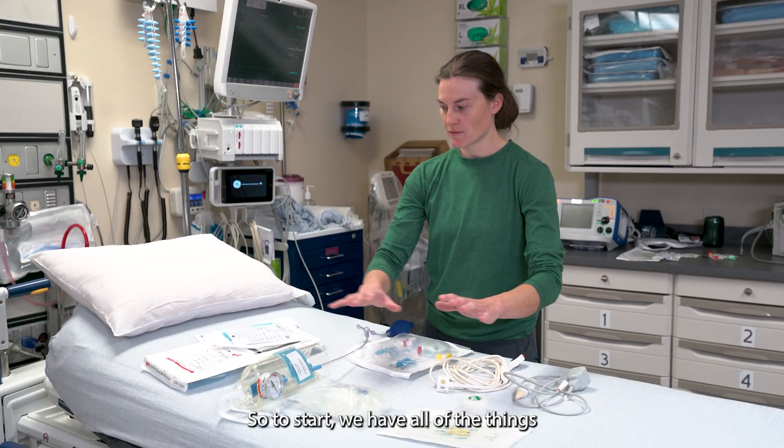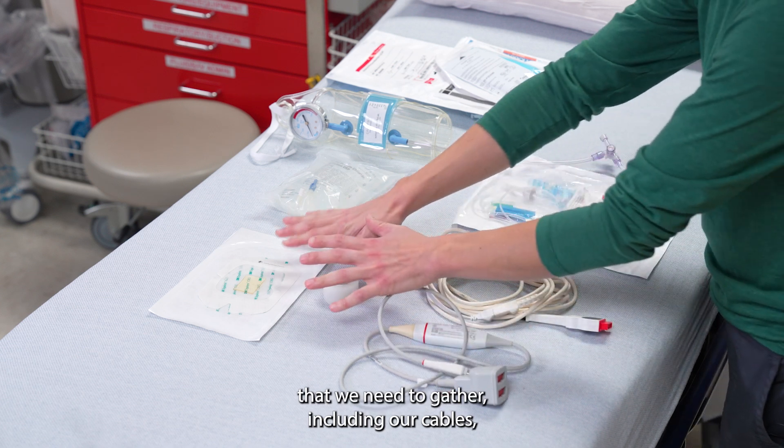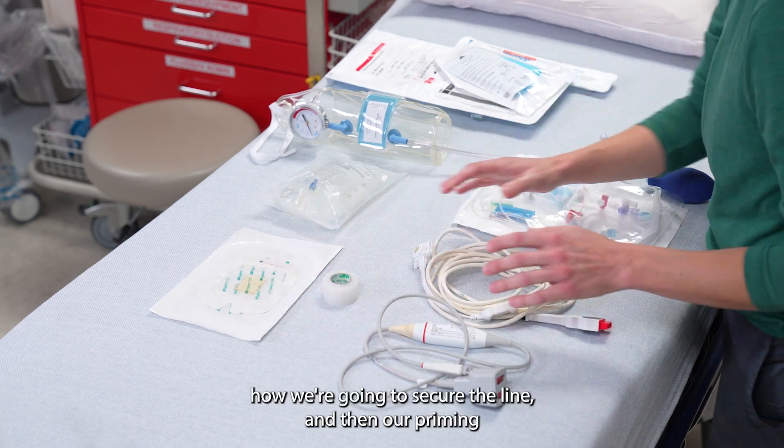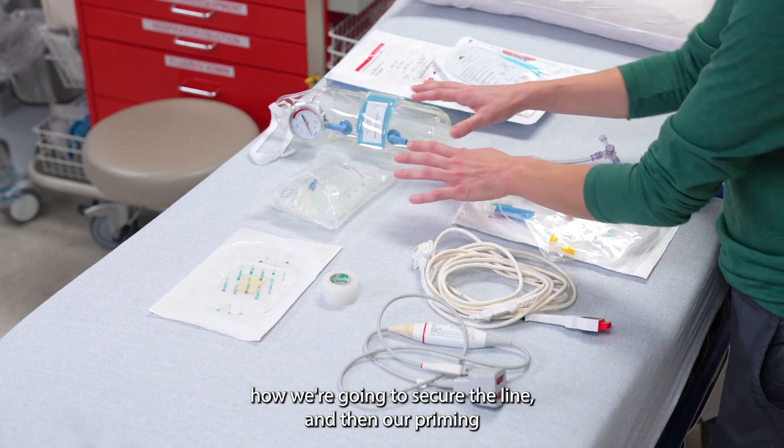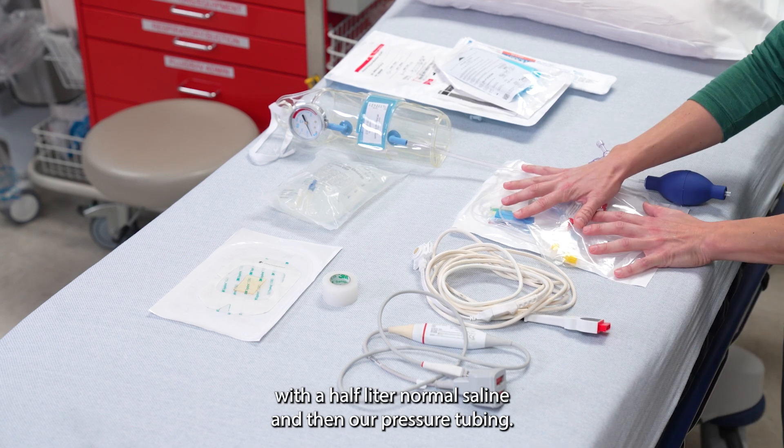To start, we have all of the things that we need to gather, including our cables, how we're going to secure the line, our priming with a half liter normal saline, and then our pressure tubing.